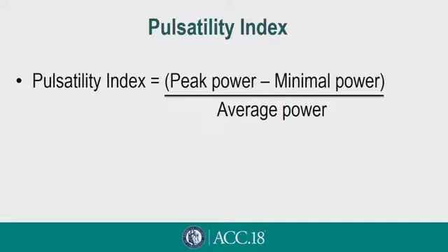It can be measured in milliseconds and averaged over a course of time. When there's a rapid decrease in the pulsatility index, the pump computer interprets that as a suction event and can reduce speed. So these are inherent control mechanisms that look at flow adjustments to prevent some of the untoward events of the LVADs.